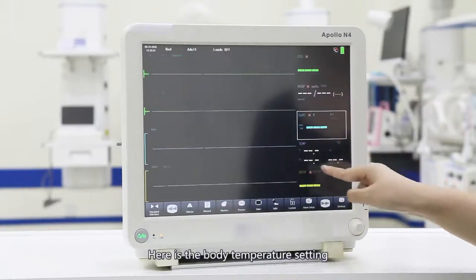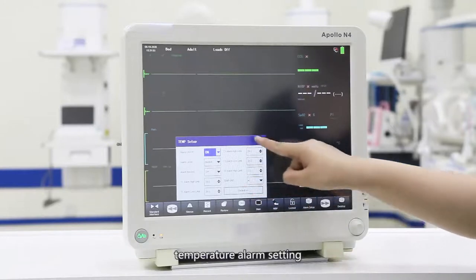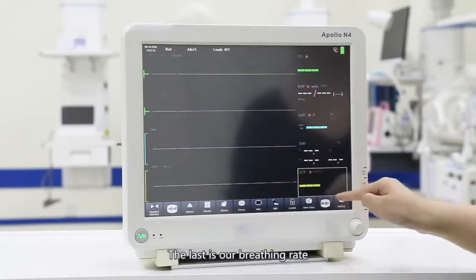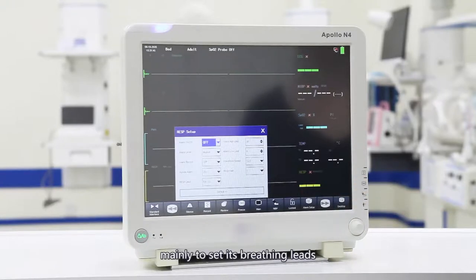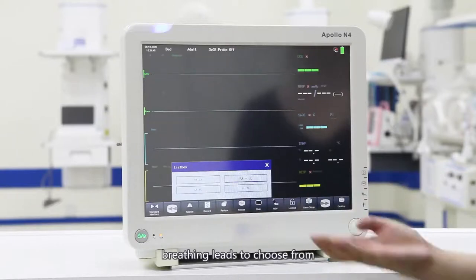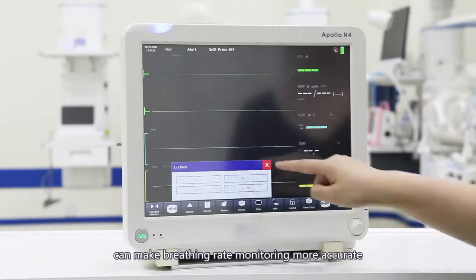Here is the body temperature setting. Our device supports dual channel body temperature measurement. The right side is the body temperature alarm setting. The last is our breathing rate. The breathing rate setting is used to set the breathing leads. There are a total of four breathing leads to choose from, and choosing a suitable breathing lead can make breathing rate monitoring more accurate.